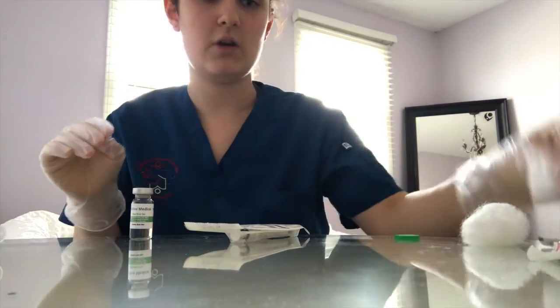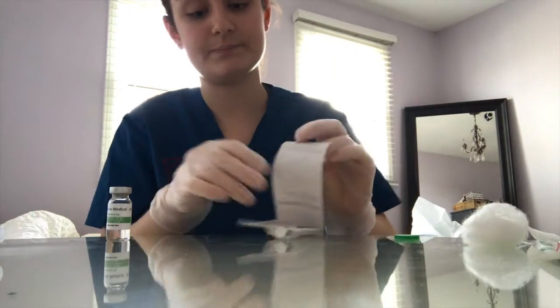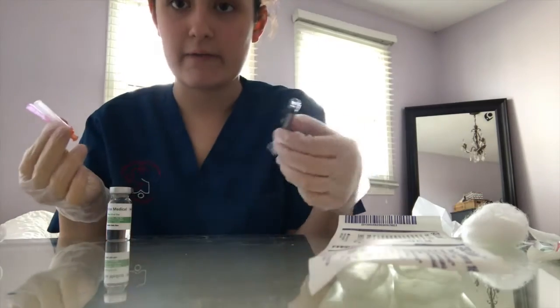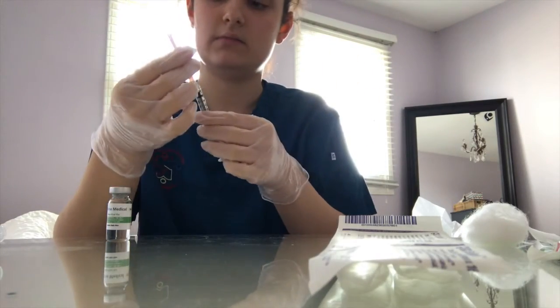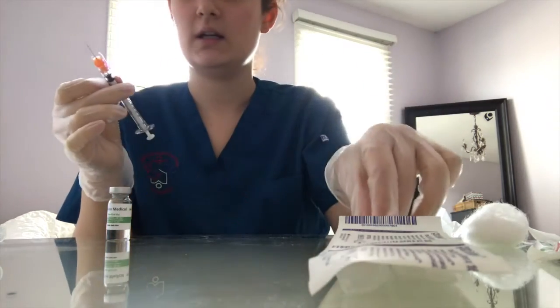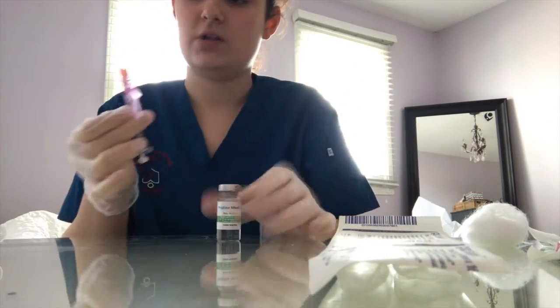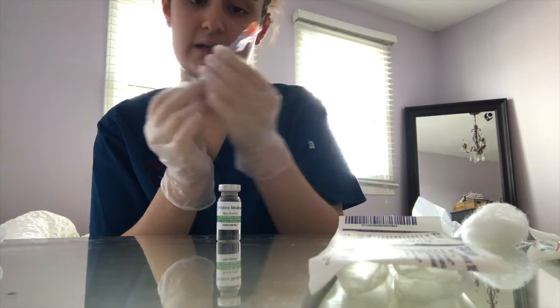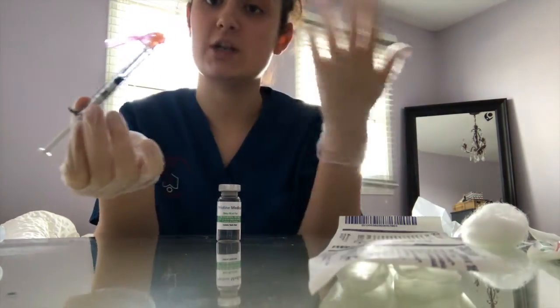You wipe with your alcohol swab, make sure there's no bacteria, let it dry, open your package. Again, using the smaller syringes for smaller doses of medication. Since we're giving 5,000 units, we would want to use the 1 mil. You put it on like this. It's very similar, okay? You've seen. It's dry. Do the same thing. I don't know if this is necessary, but I don't see a problem with it. Same amount of volume that you want of medication, pull back with air.